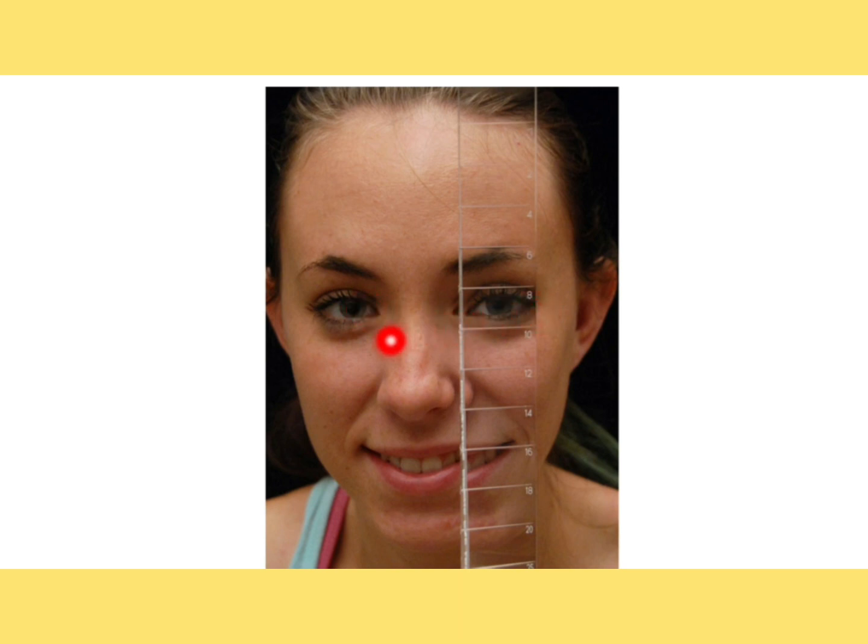You need to allow the patient to see binocularly, where you will place the prism bar base-in in front of one eye. The target will be a line target or a dot target, but you should not give the patient a letter target because it can induce accommodation. Since we are checking the patient's ability to diverge, accommodation should remain unchanged — that's why you give a line target.